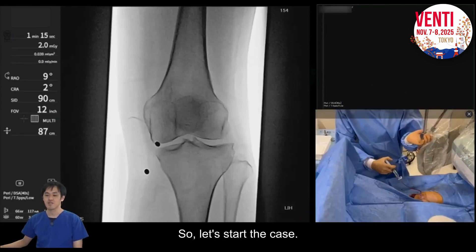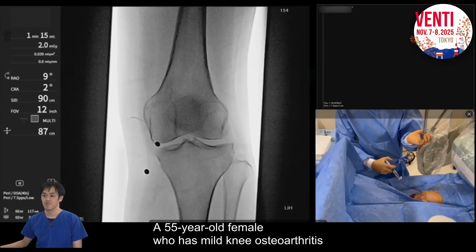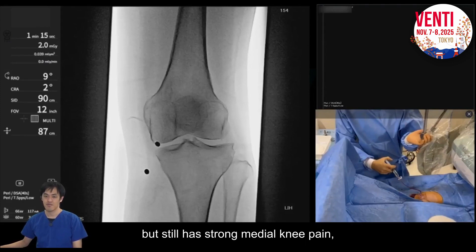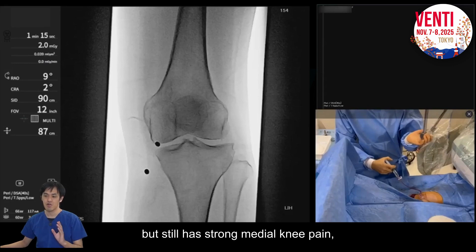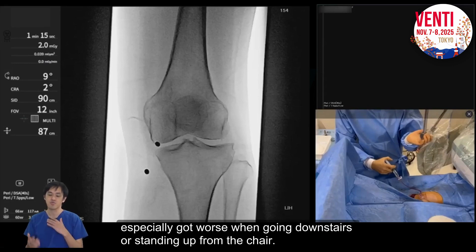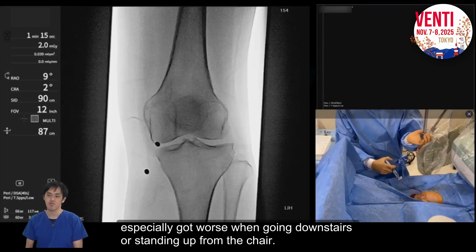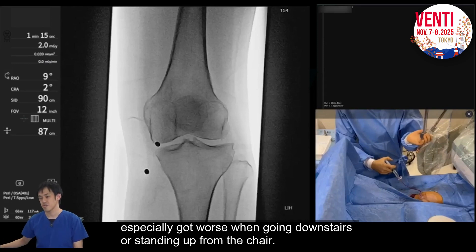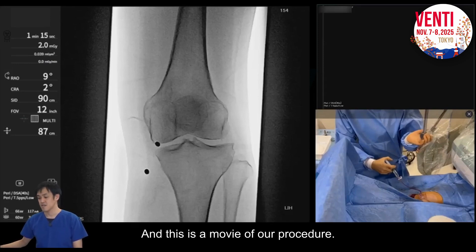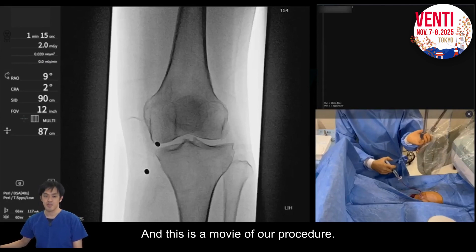Let's start the case. A 55-year-old female who has mild knee osteoarthritis but still has strong medial knee pain, especially worsened going downstairs or standing up from a chair. This is a movie of our procedure.